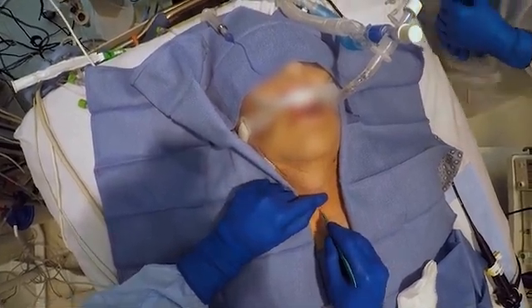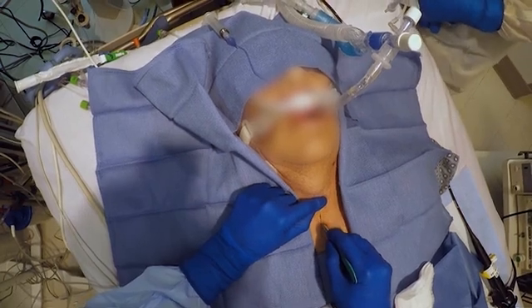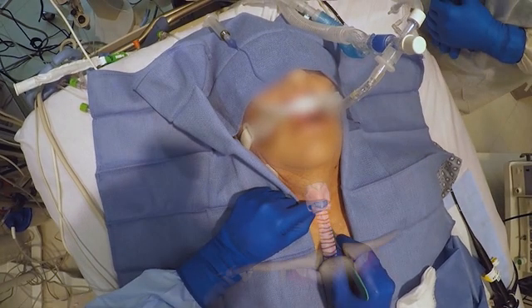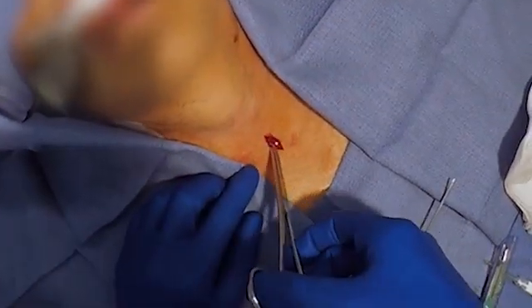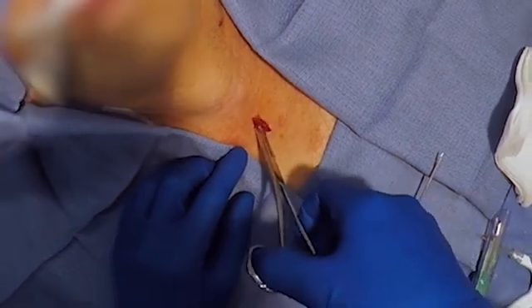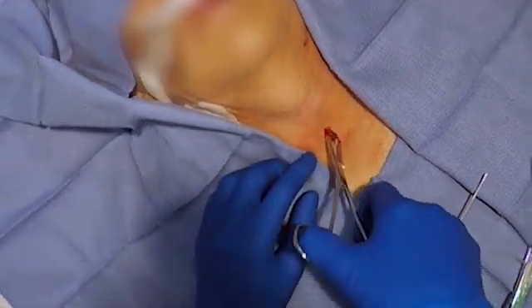Next, make a two to three centimeter vertical neck incision that directly overlies the trachea below the cricoid cartilage. Bluntly dissect the pre-tracheal tissue with a dissecting tool until the trachea is clearly palpable.